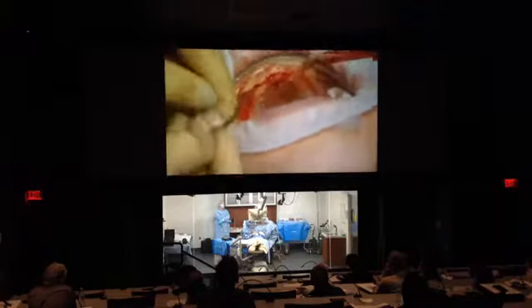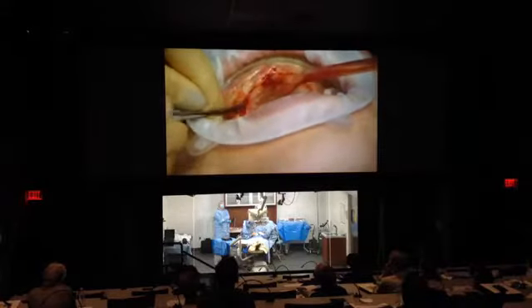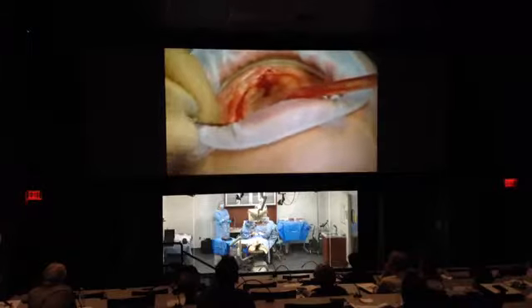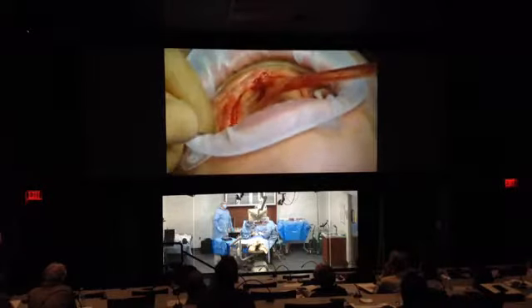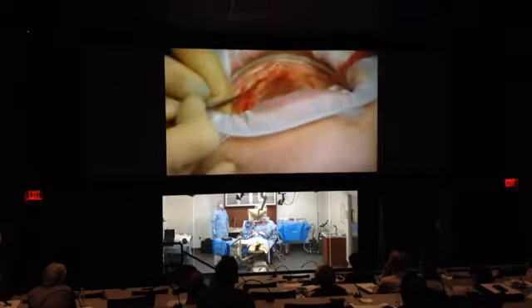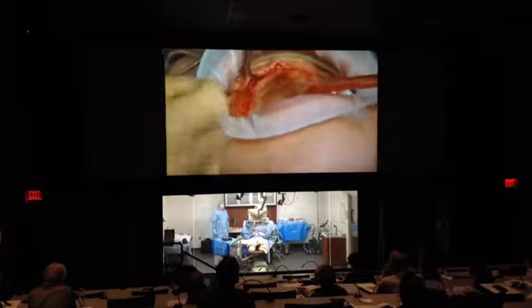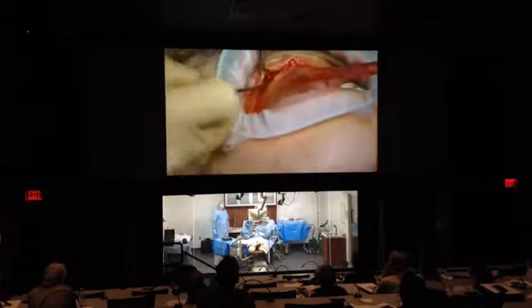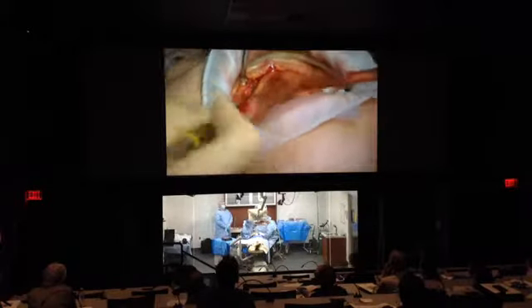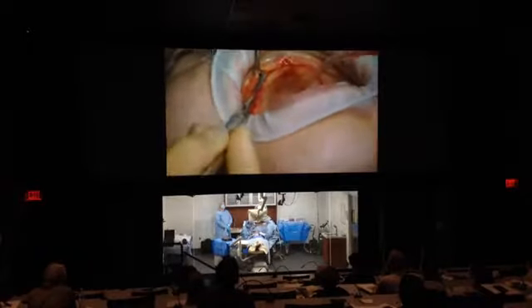You okay, Anoria? Good. We have an amazing patient today. You see here it's quite a bit fibrotic, so it's good to clean this fibrous tissue as we go along. It's going to get a little more difficult as I get anterior here. Smaller elevator. I like to use something a little bit sharper.